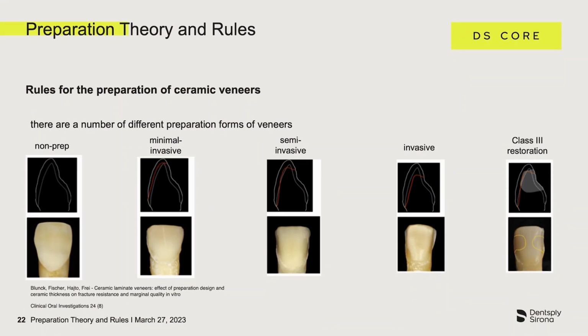We now turn to the preparation guidelines for ceramic veneers. The following pictures now show us 5 different designs for the preparation of ceramic veneers. We speak of non-prep veneers, minimally invasive veneers, semi-invasive veneers, invasive veneers, and Class 3 restoration.